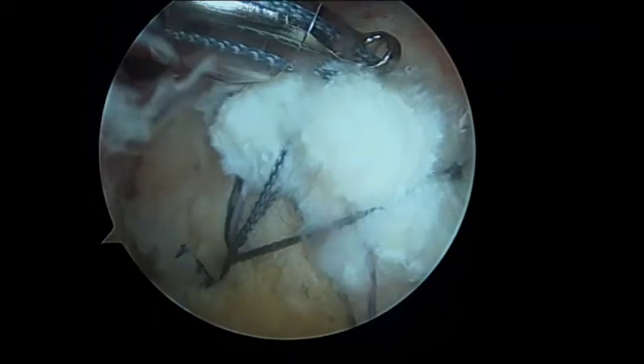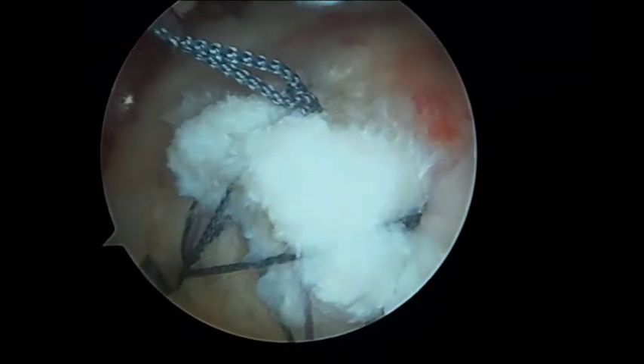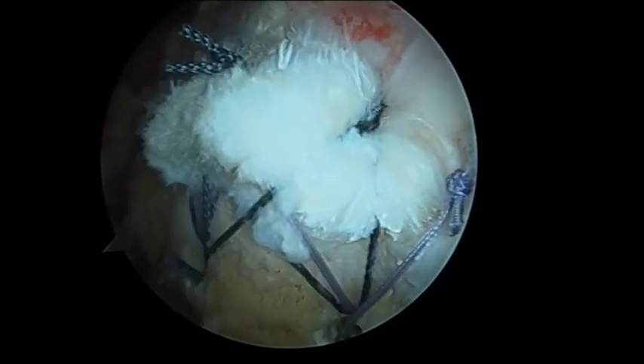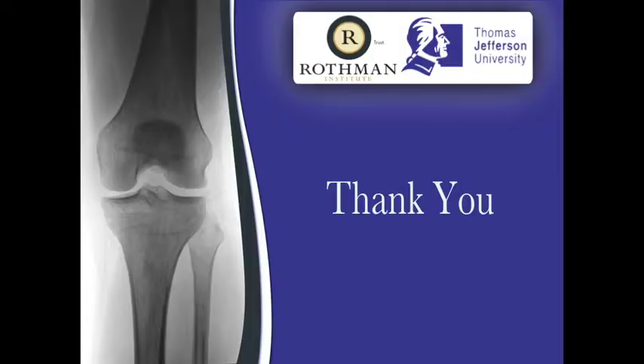If a single lateral row is to be used, the suture limbs not incorporated into the lateral row anchor are then cut. We present our method for addressing bursal-sided partial thickness rotator cuff tears using an in-situ repair technique with double row suture anchors.